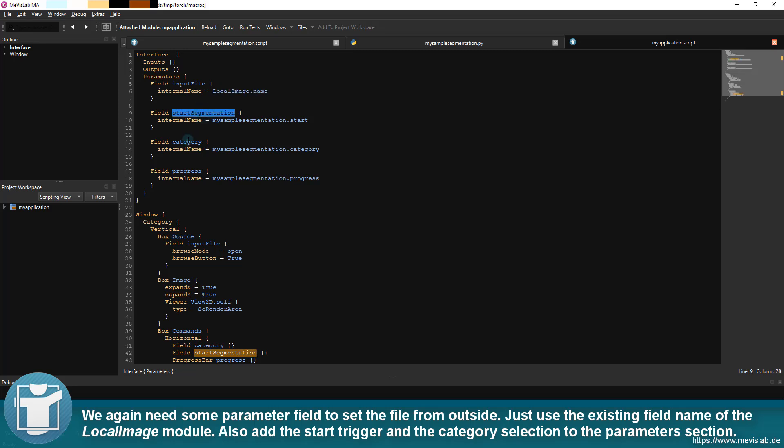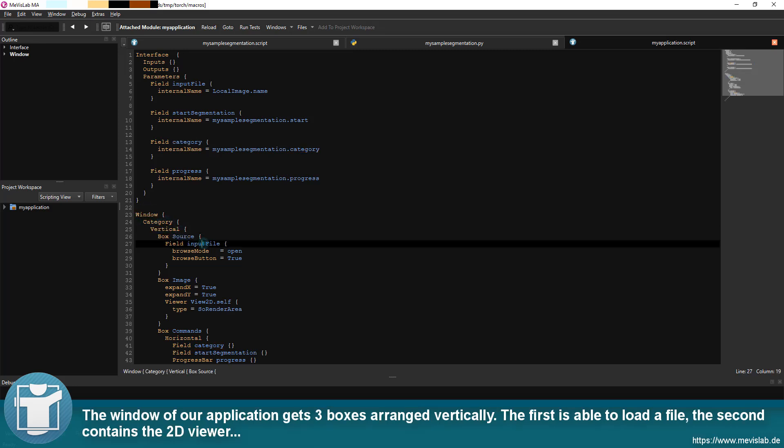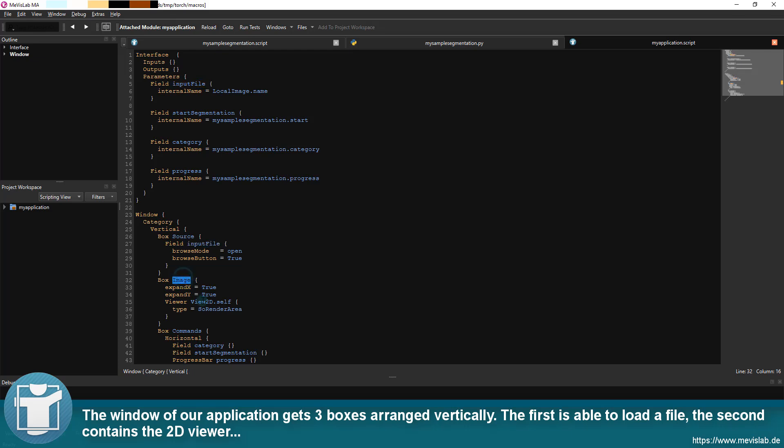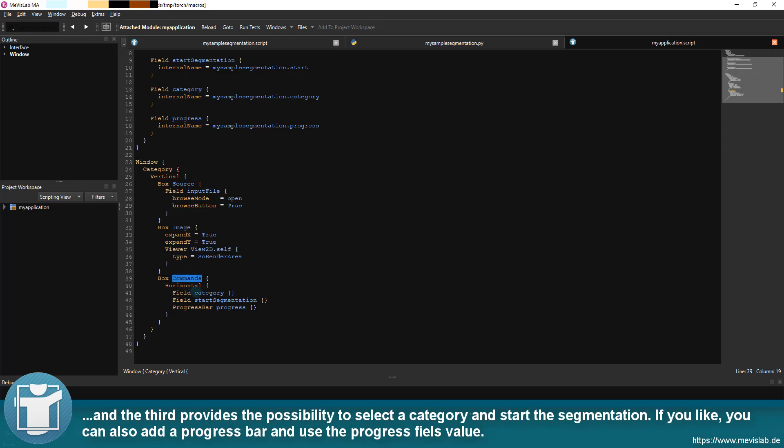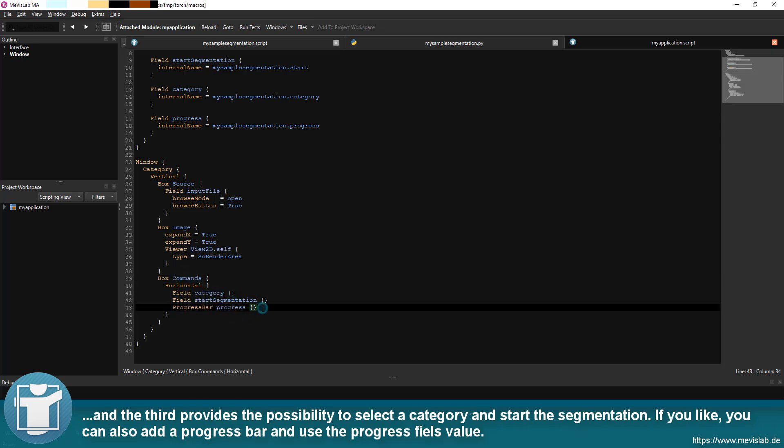Also add the start trigger and the category selection to the parameters section. The window of our application gets three boxes arranged vertically. The first is able to load a file, the second contains the 2D viewer and the third provides the possibility to select a category and start the segmentation.